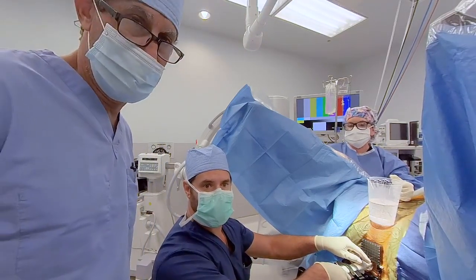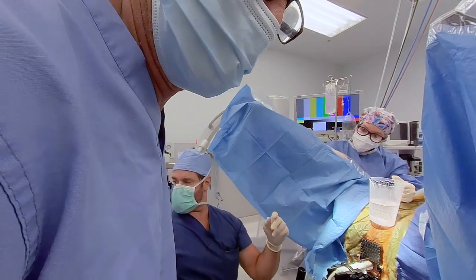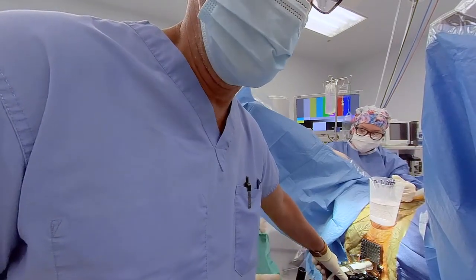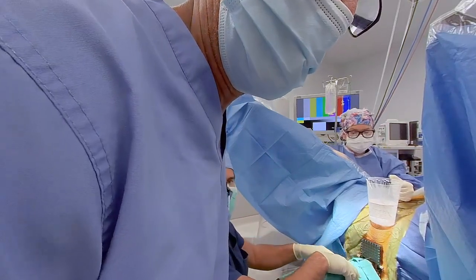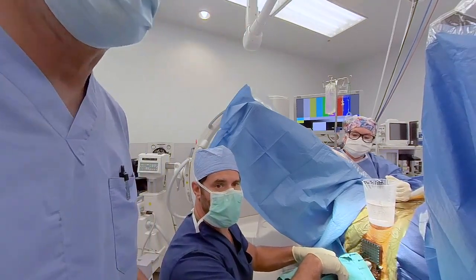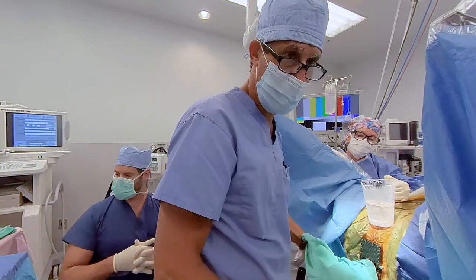Avi, let us know when you're ready to get a sagittal image. Capture. So we capture a sagittal image to identify the position of the urethra relative to the bladder neck and the apex. Okay. We're ready to capture images. You ready, Avi? Yeah. So once we put in our anchoring needles, we capture the images.